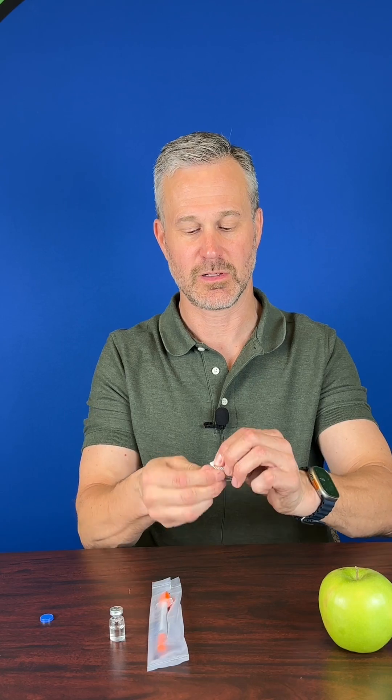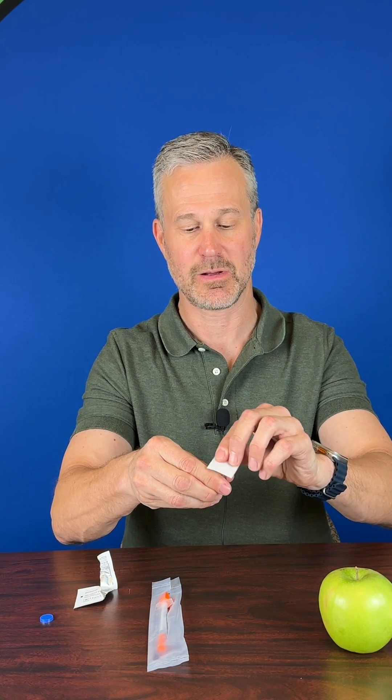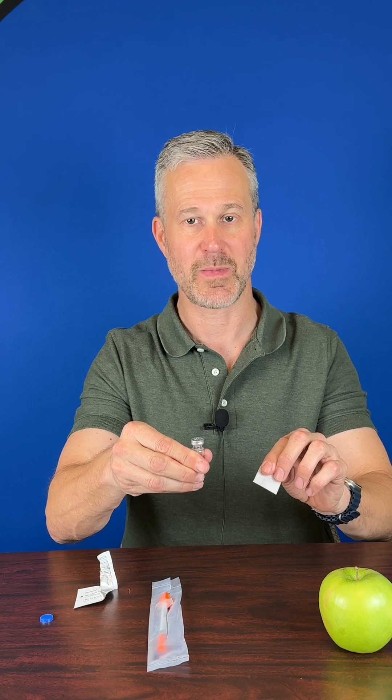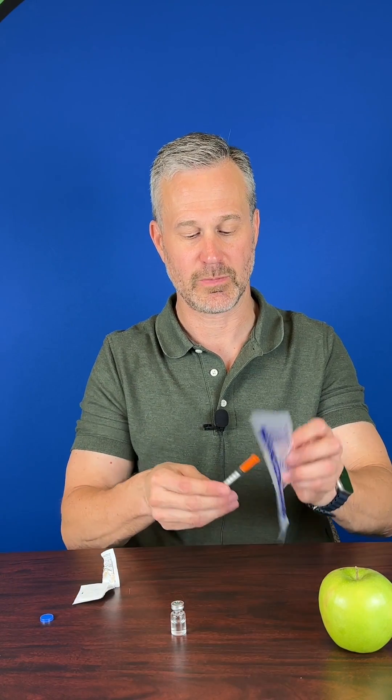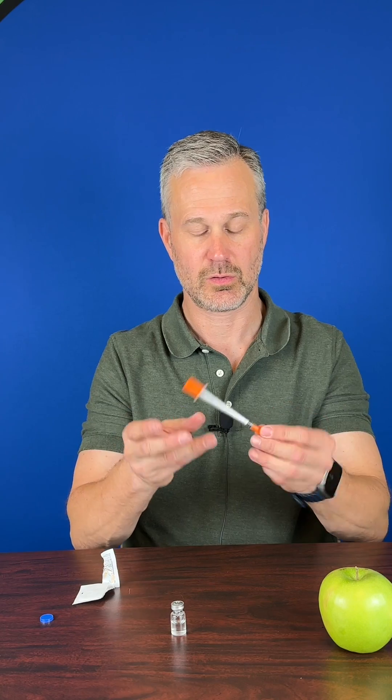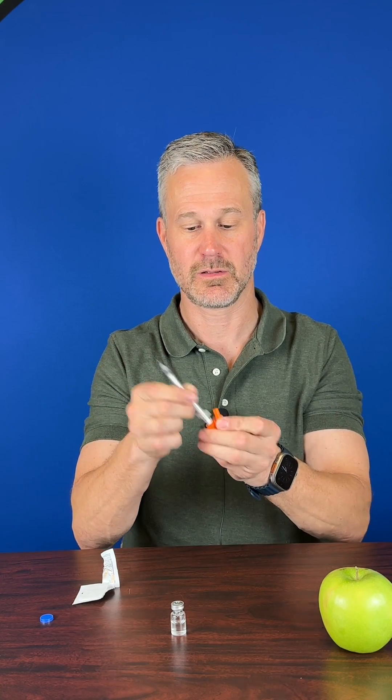Once you open up the vial, take your alcohol pad and wipe off the top rubber stopper of your medicine vial. Once you've done that, open up your syringe, taking off the protective safety caps, one on the front and one on the back.